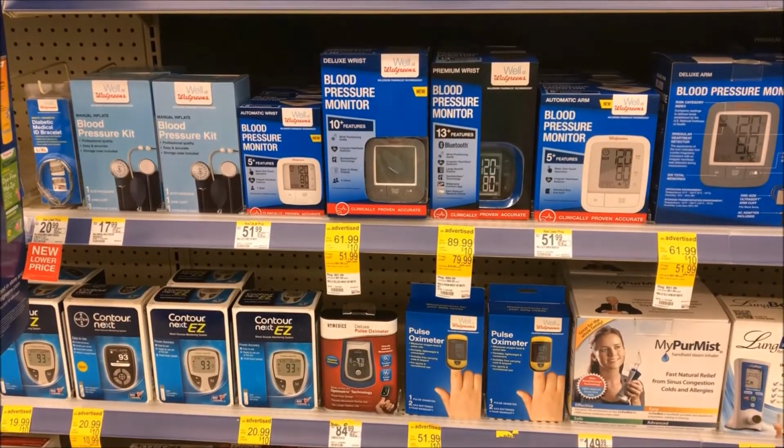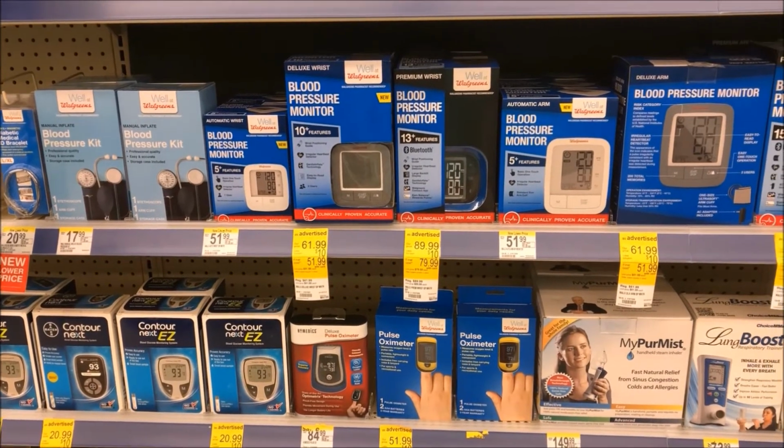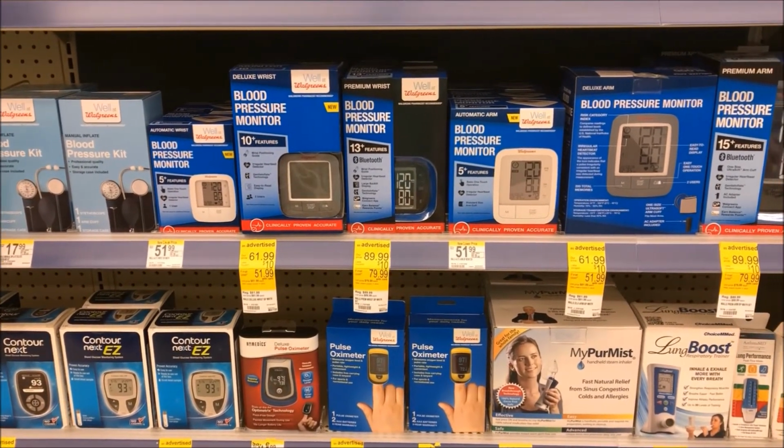Automated blood pressure monitors need to be clinically validated in at least 85 patients before they can be marketed, but this doesn't guarantee their accuracy on an individual patient. We found that some automated blood pressure monitors are accurate on some patients, but inaccurate in others. We suspect this is based on a particular monitor's algorithm and whether or not that one is suitable for that particular person. Unlike weight or height, blood pressure is usually measured indirectly.